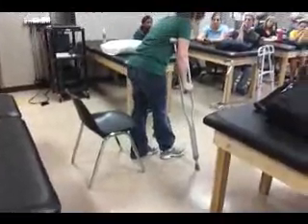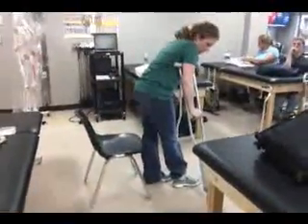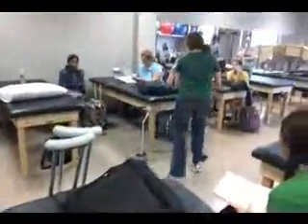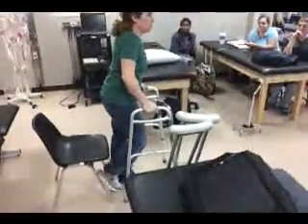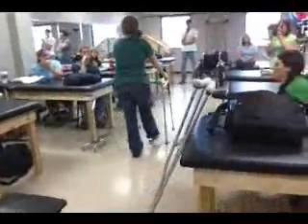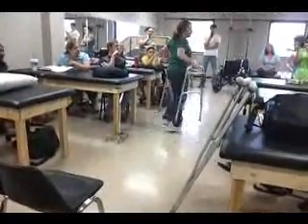Well, let's hold on real quick. Because I could do that with my crutches. I could also do it, let's say if it was somebody that was a little older, with a walker as well, right? So if it's an older person, are they going to feel more comfortable with crutches or a walker? A walker. So I'm still non-weight bearing, and I'm in my 3-point.